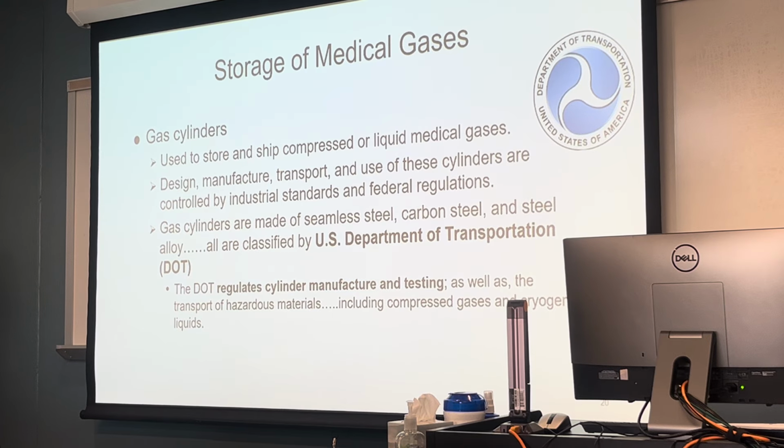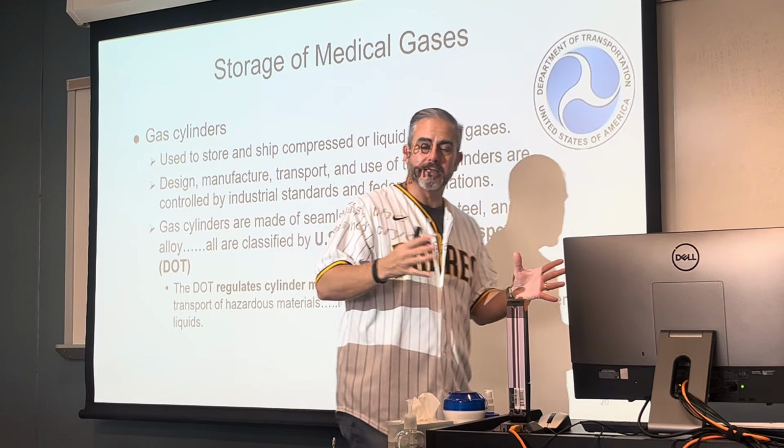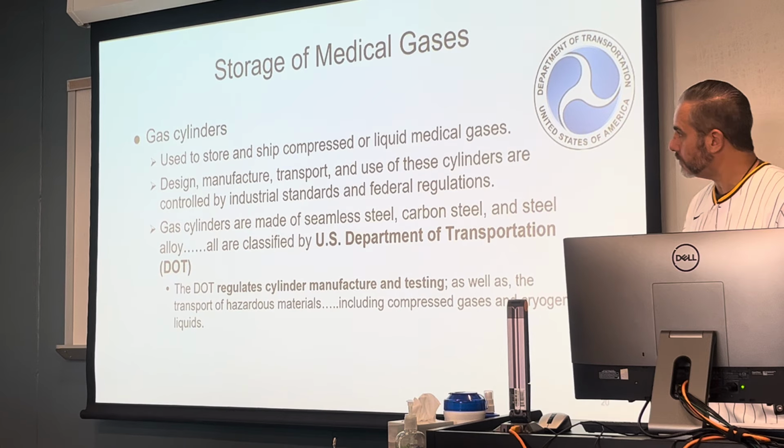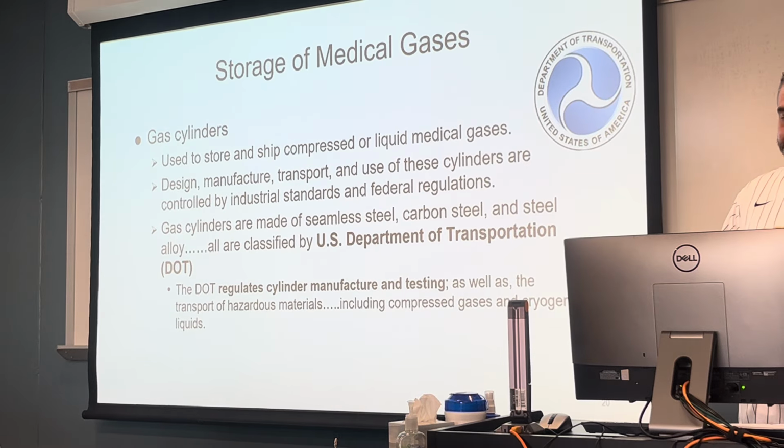All right, so let's move away from, so those are the medical gases. Those are the medical gases. Obviously, some you see more frequently than others. All right, let's talk about the cylinders. The cylinders themselves that store these medical gases.